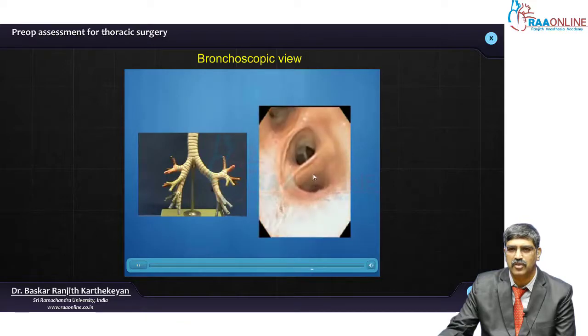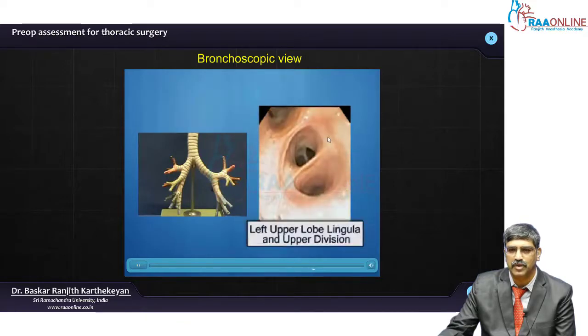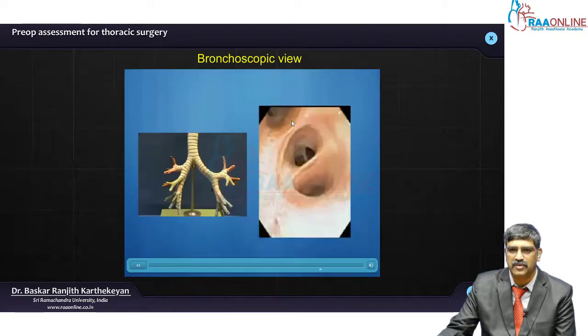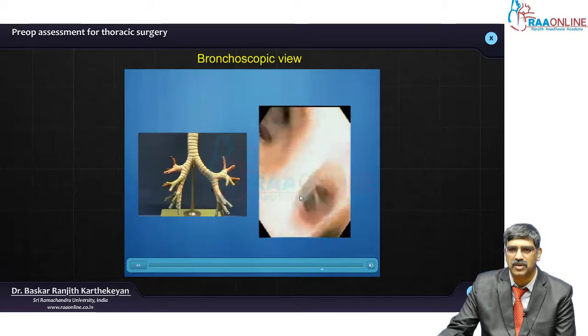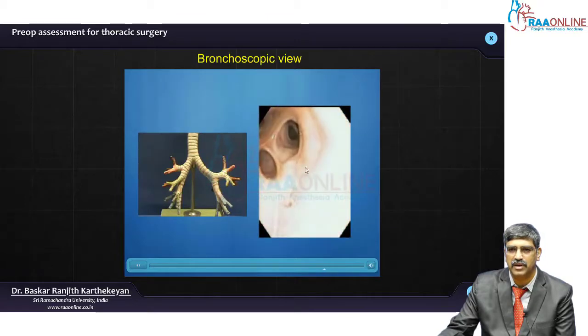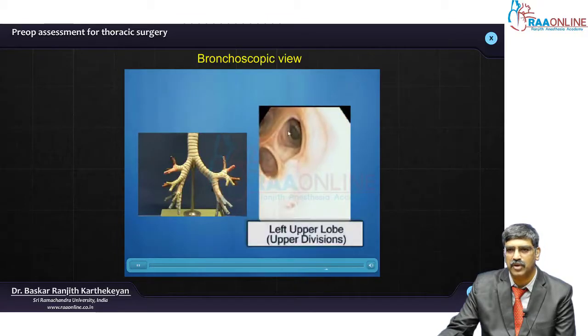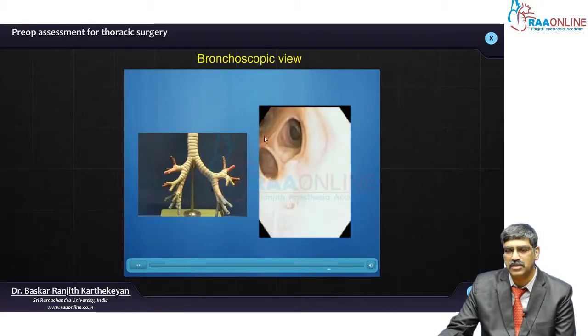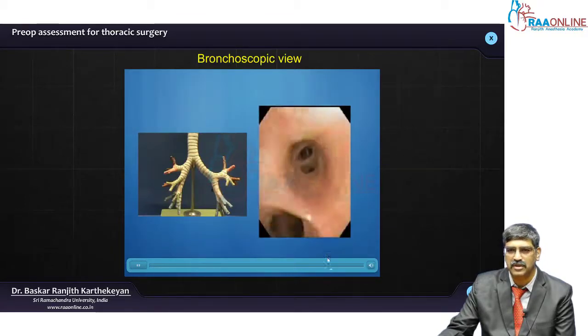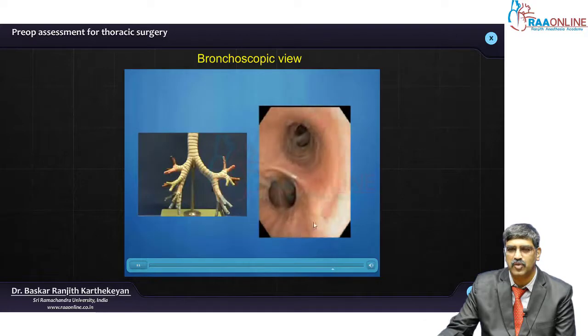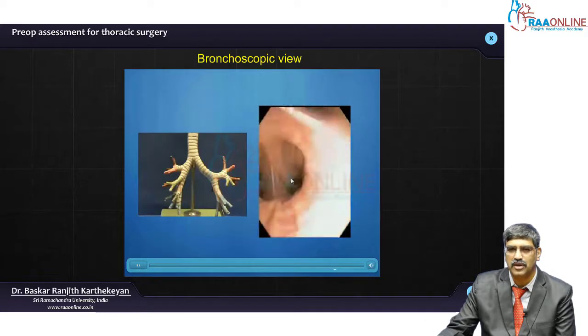As you enter the upper lobe, you can see the upper lobe division — lingula here and the upper division here. The lingula can be superior and inferior, and in the upper lobe you can see 3 segments.